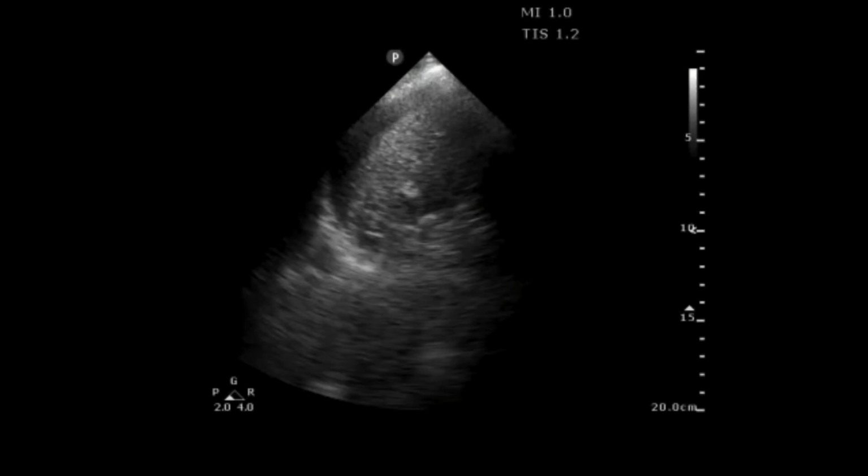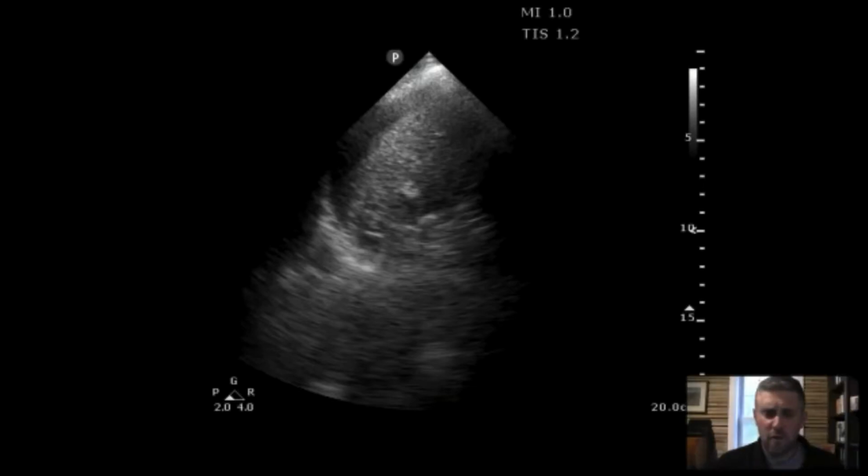And it has to do with the peritoneal reflections inside the abdomen that make it really, really hard for fluid to migrate through all those reflections and into that splenorenal space. And it's really easy to shoot up that gutter and right around the top of that spleen, right? So as we do our studies at the bedside, keep this case in mind. This is a great place for us to look, right? As we do our left upper quadrant, make sure you're looking at the spleen and the diaphragm, what's between the two, as well as the spleen and the kidney and what's between those two, right?